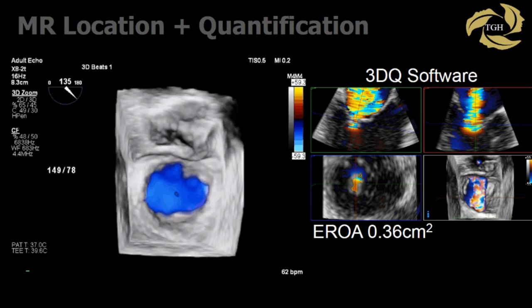I'll close with 3D color. You can use it — and it's important — to look for MR localization. You can take it to 3DQ software or any multi-planar reconstruction software and actually trace out the EROA. You can see that the EROA is not circular. We calculate a physiological EROA based on various parameters, but now you're looking at a more anatomical one. It's important to note this is at a 16 Hz frame rate — the better the frame rate, the more images you can actually use.